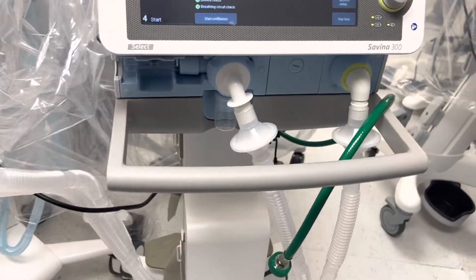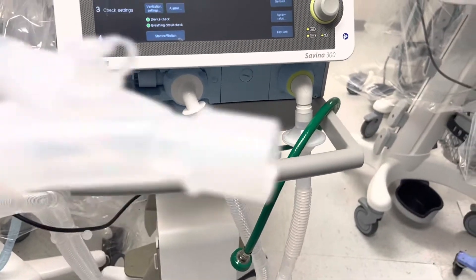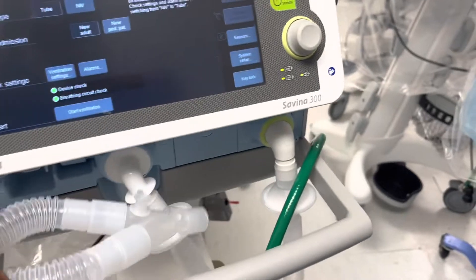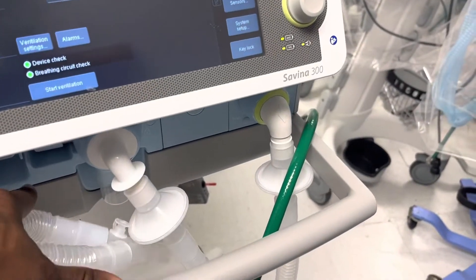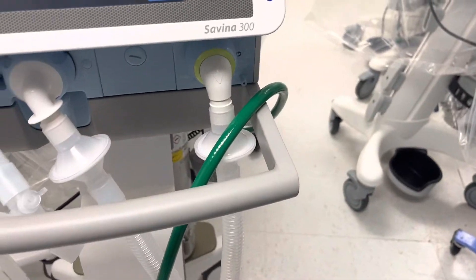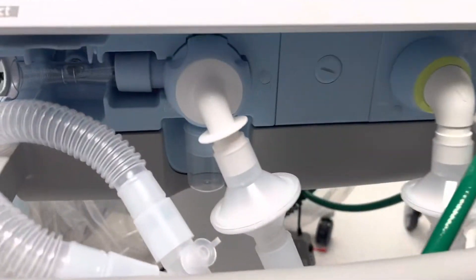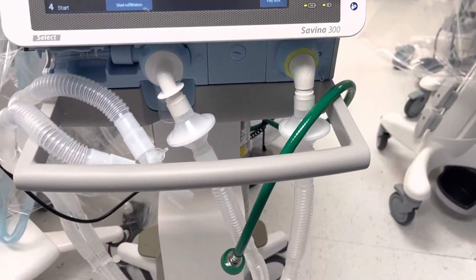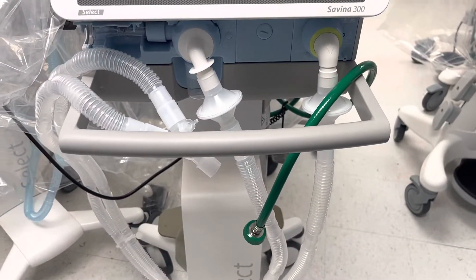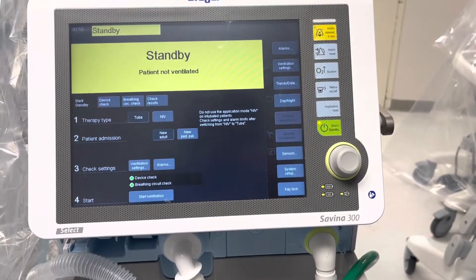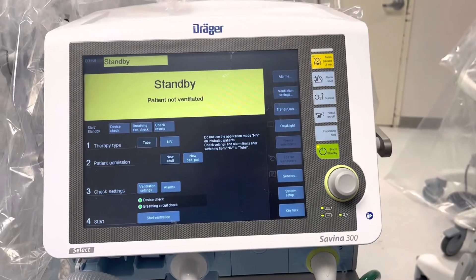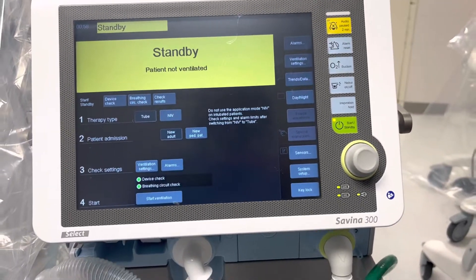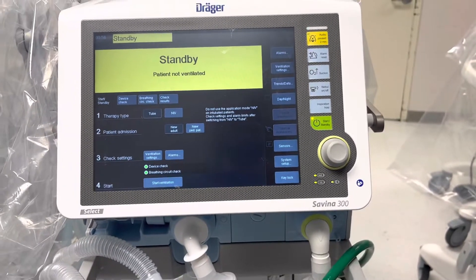The inspiratory and expiratory limb connect to our wye connector, where our HME and Ballard will most likely go. We can also see our green line for our oxygen connection. This is a quick overview of our Draeger Savina 300.